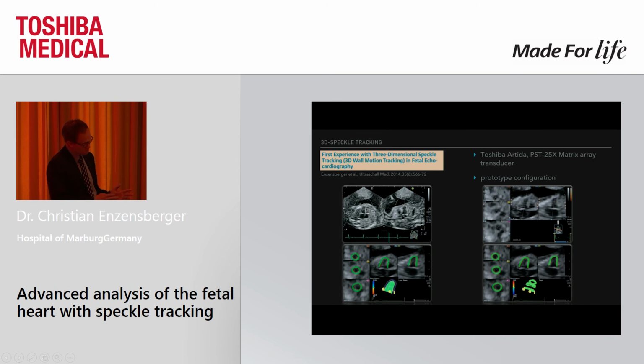It's a bit different from normal scanning because you are scanning simultaneously in 3 dimensions with a matrix probe. This is a case of a 20-week-old fetus. You have your normal 4-chamber apical view, the perpendicular view, and the 2-chamber view.